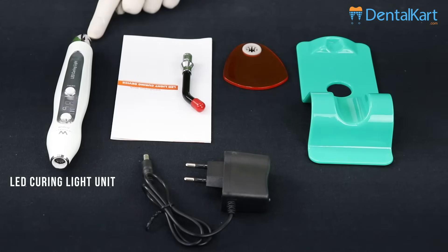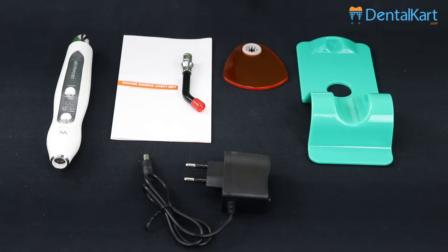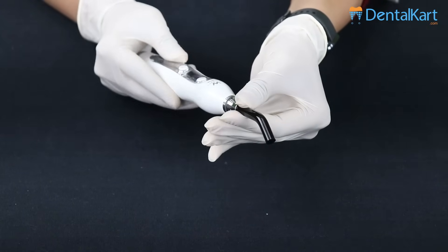This is the LED curing light unit, user manual, light guide stick, light protector, plastic stand, and power adapter. The light guide stick will be pushed inside the main unit by slight rotation.